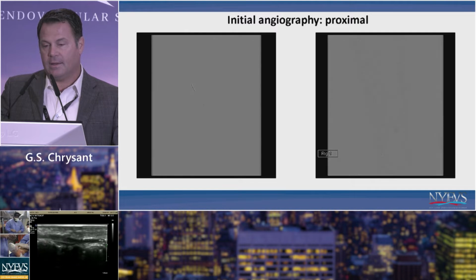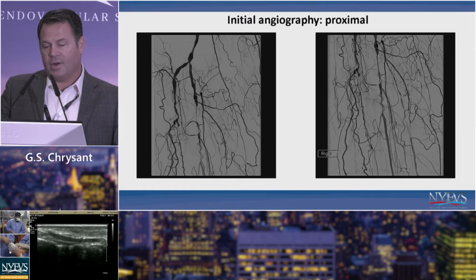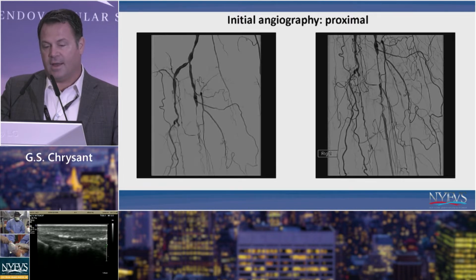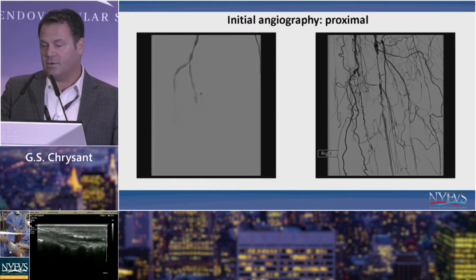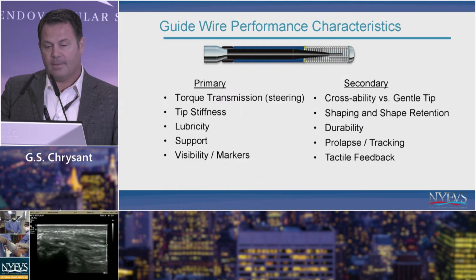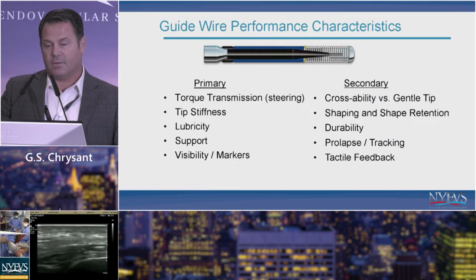And then this will be a little bit slow, but essentially what you have is a peroneal that reconstructs itself or reconstitutes itself after a reasonable length, and an anterior tibial that's gone and a posterior tibial that's gone proximally, but then starts to reconstitute in the mid-vessel, as you can see on the right, as far as the posterior tibial. Further downstream, if it plays, you'll see more vessel that reconstitutes, or not. Okay, you can take my word for it.